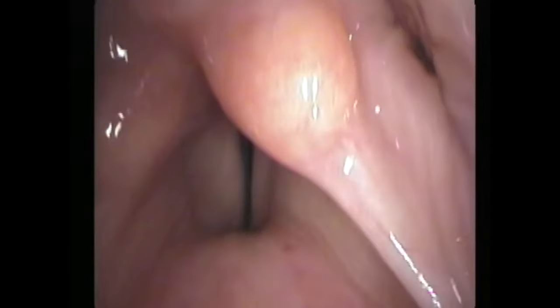We have our endoscope in the posterior commissure and made a recording. I've stopped the frame here where the right vocal process is essentially in the midline, leaving it parallel to the membranous cord, while the left side is canted laterally. And this leaves a gap on the left side to leak air.